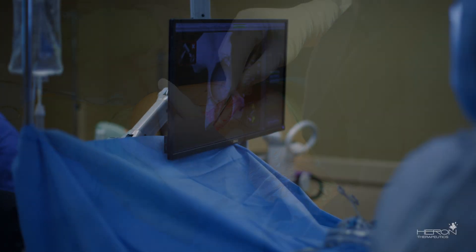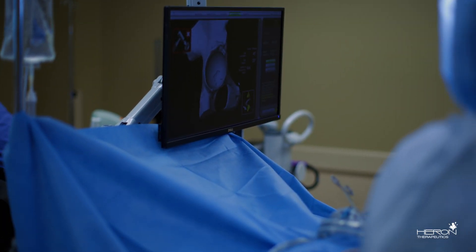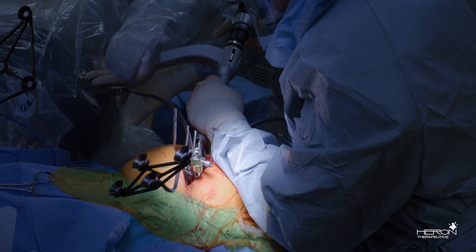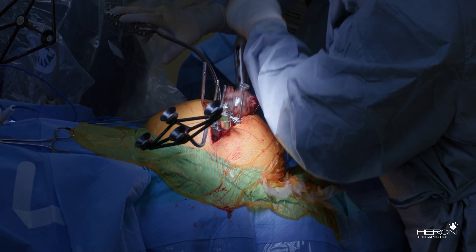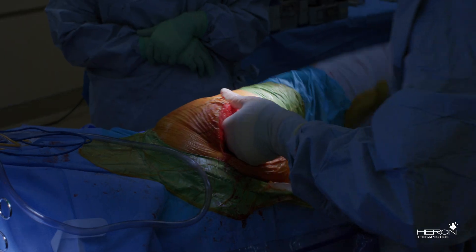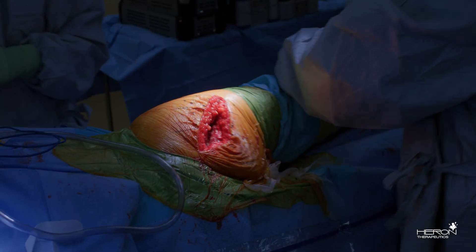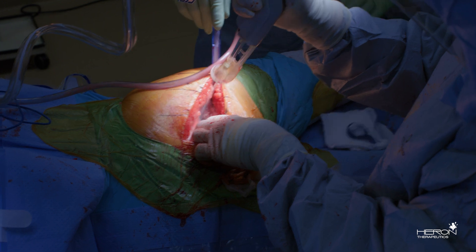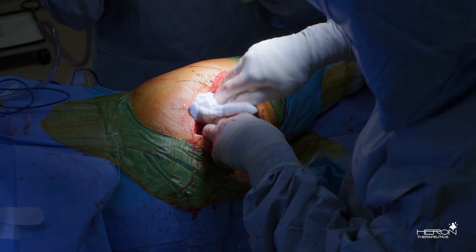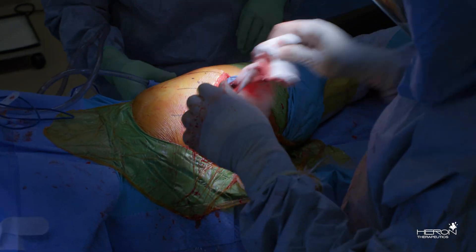I do a direct superior approach and a robotic total hip. The video is going to show us doing a total hip replacement with the robotic arrays in place. We're just completing insertion of the implant, we're going to reduce the hip, put it through a range of motion, and after that we're going to irrigate the wound. You want to make sure that you dry the wound completely before applying the Zen Relief into the wound so it doesn't get diluted.